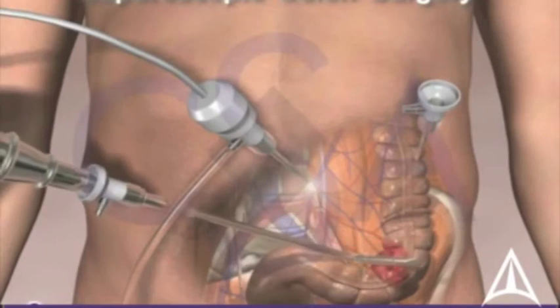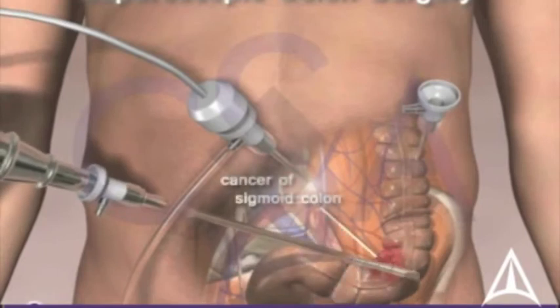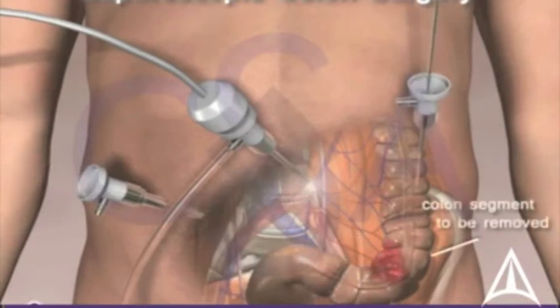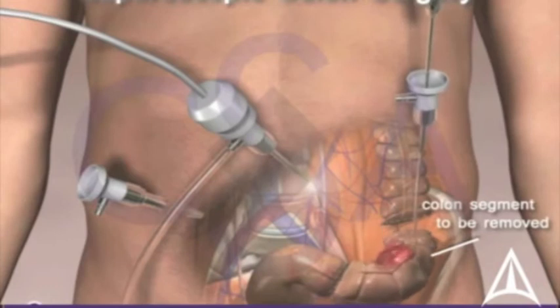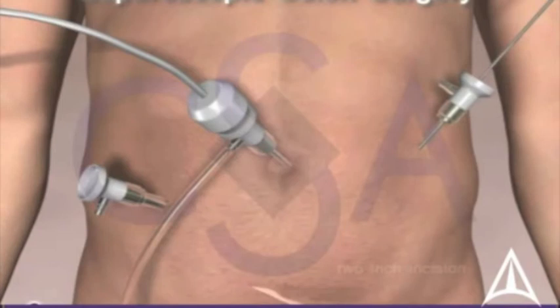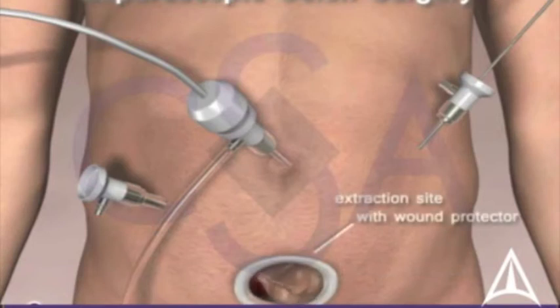An area above and below the tumor is identified and isolated. The segment is then divided and removed through a small 2-inch incision, shown here in the lower abdomen.